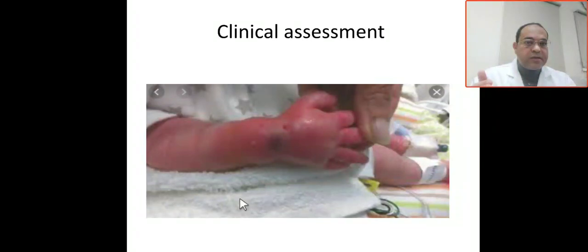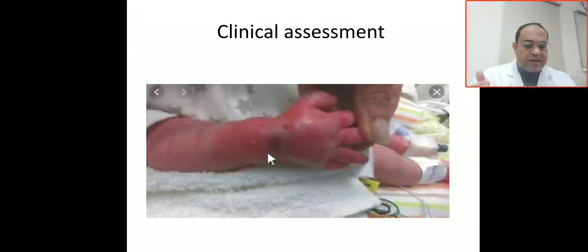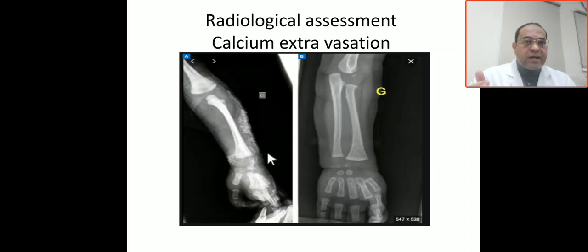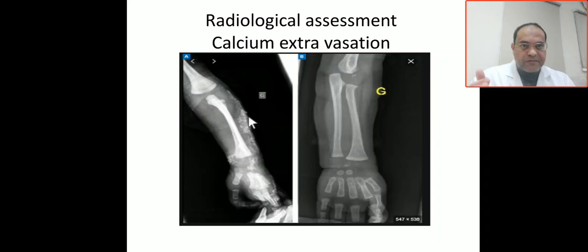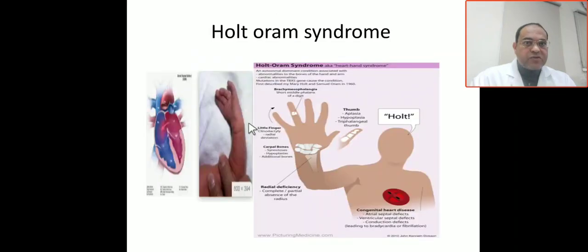As mentioned before, this is the clinical assessment: soft tissue swelling due to extravasation and discoloration in the wrist area. This is the radiological assessment: calcium extravasation showing as calcium infiltrations on X-ray. Clinically we see soft tissue swelling, and radiologically we see a radio-opaque shadow due to calcium infiltrations from extravasation of IV calcium-containing fluid.